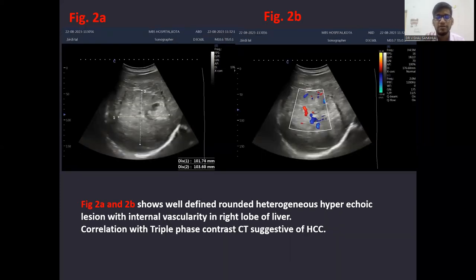This case shows a well-defined rounded heterogeneous hypo-echoic lesion with internal vascularity in the right lobe of liver. On correlation with triple phase contrast CT, it is suggestive of hepatocellular carcinoma.